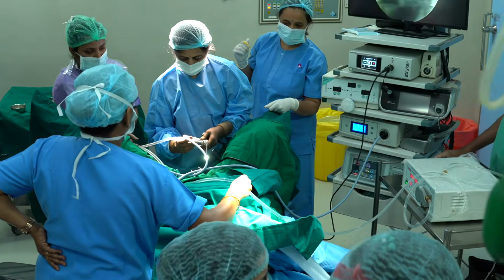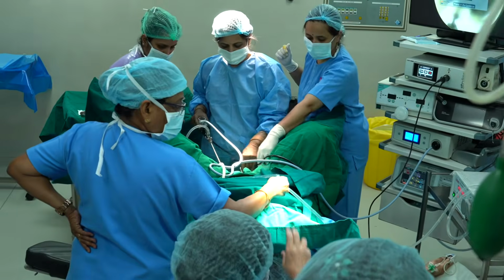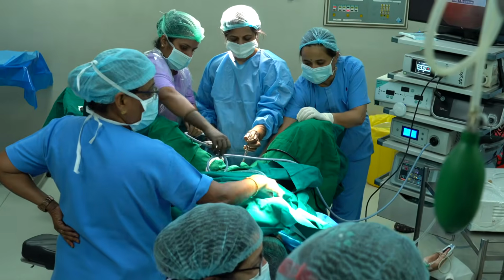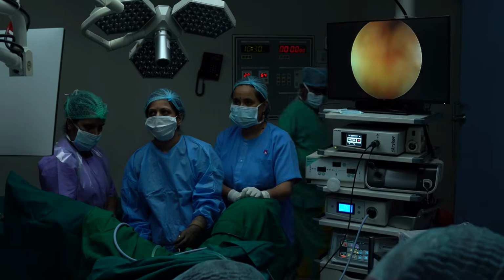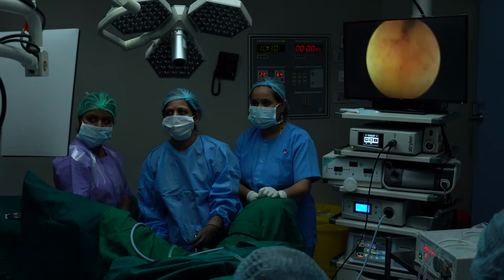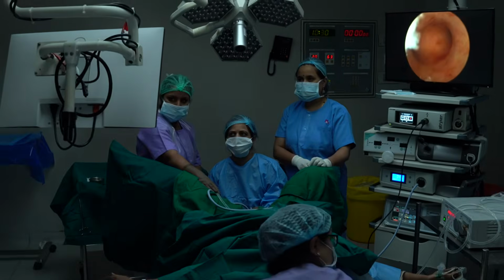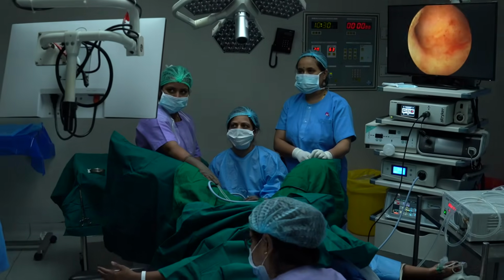Here I am entering into the uterine cavity through the vagina and the cervix. As you can see here, I have switched on the normal saline flow, and I will be looking at the screen while I am doing this procedure. So the lights are turned off. You can see that the cervix is entering now. The scope has illuminated, and you can see the mouth of the cervix, and the uterus is now entered.